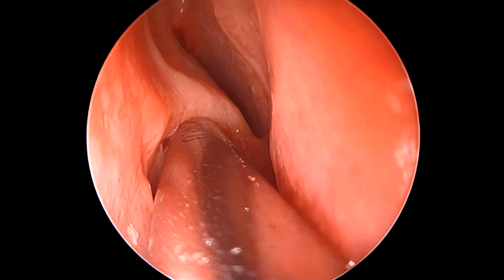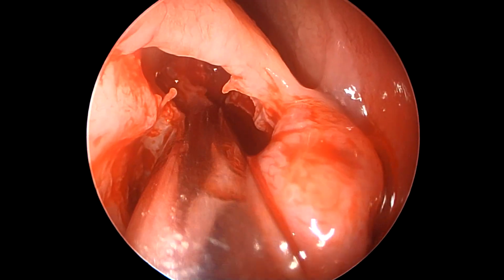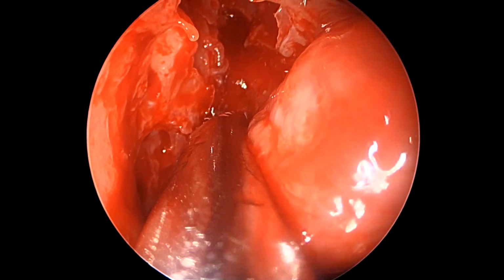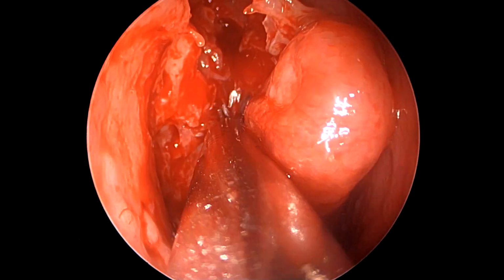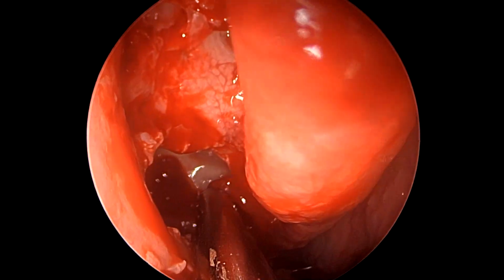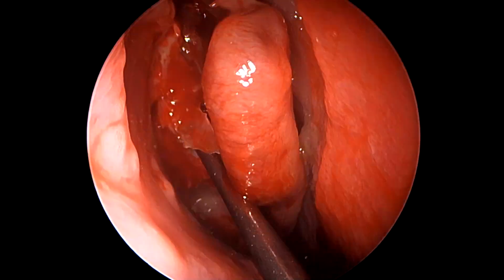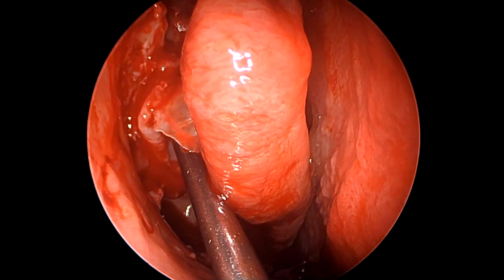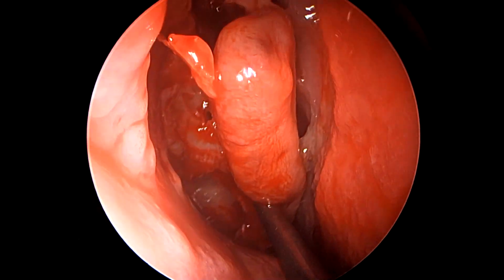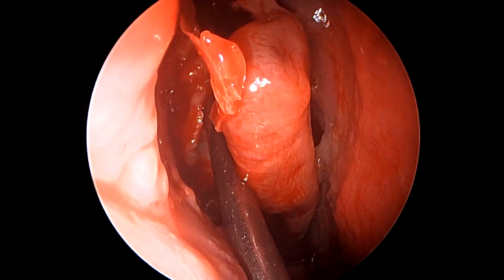As we remove the anterior wall of the agger nasi slightly, one must also be mindful of the orbit just laterally, because that is the lateral boundary of the frontal recess. So as we see here, with the bulla still intact and the maxillary antrostomy done, we have just opened the agger nasi, both the posterior and the anterior wall, and now we start opening the bulla ethmoidalis to increase our working space inside the frontal recess eventually.